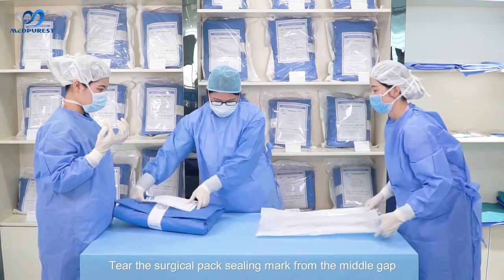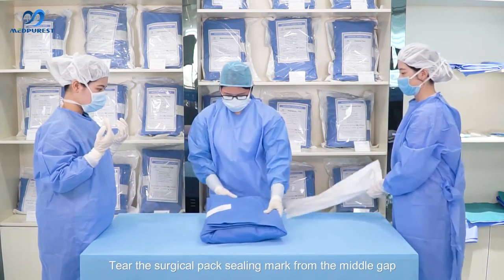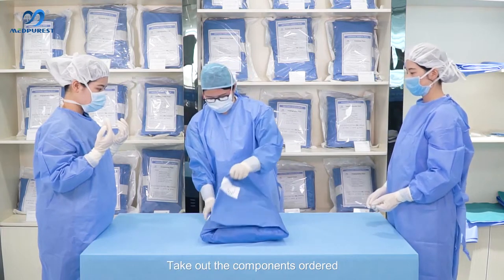Tear the surgical pack from the middle gap using the sealing mark, then take out the components in order.